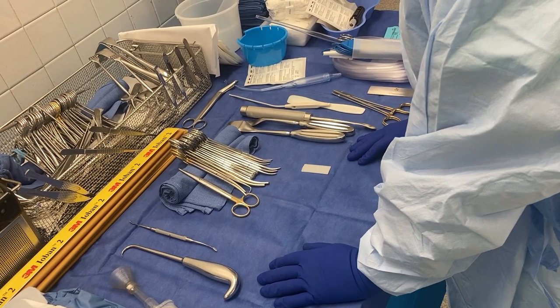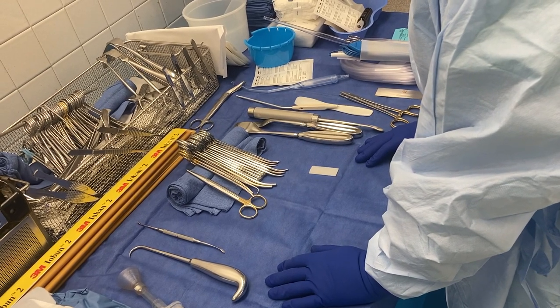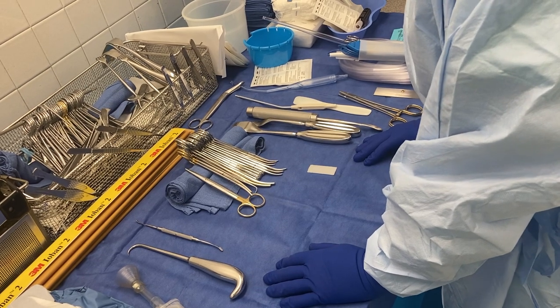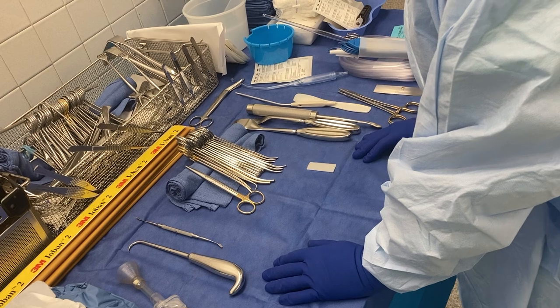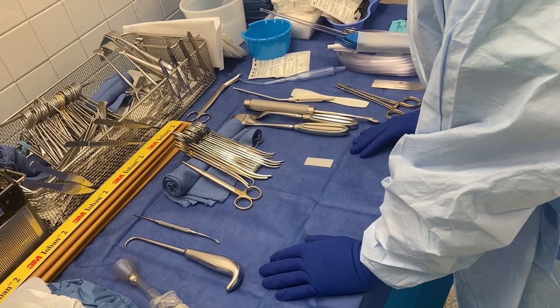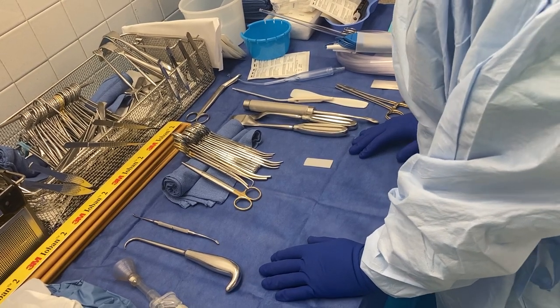The first thing is that we should probably have a sterile tourniquet because it's an above-knee amputation, and we would end up draping ourselves out if we did an unsterile tourniquet. So today we will probably do a sterile tourniquet. If the amputation has to go really high, we would not be able to do a tourniquet, and you need to keep that in mind as far as arteries and veins and being able to clamp those before you cut into them.